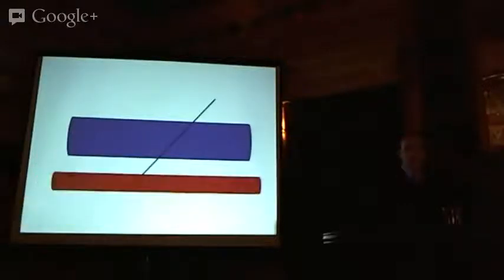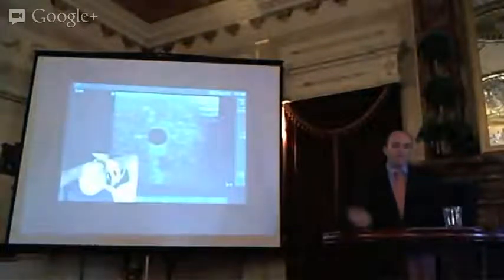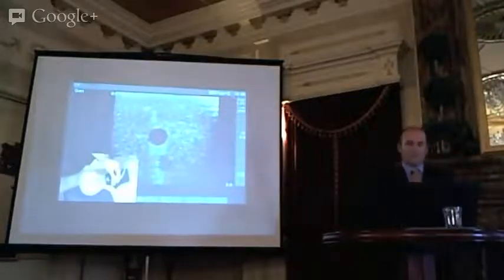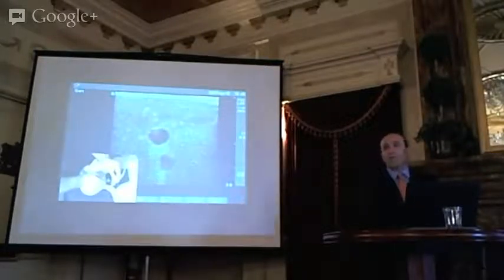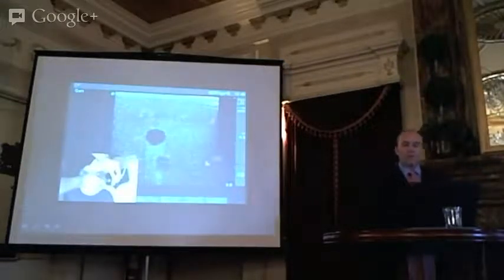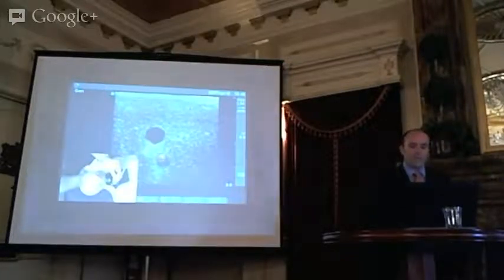Problem is, what if you actually went all the way through? You were simply scanning at this point. And for those of you that are sitting there telling yourself right now, I'd never do that, or nobody ever does that, it actually happens all the time. There's a case within not too long a driving distance up here where a physician is now defending themselves because the patient had an extremely bad outcome because of that. And I have probably three or four other vascular access related cases. The ones where ultrasound was used were all short axis, and we'll talk about this more when there's several where ultrasound was not used.